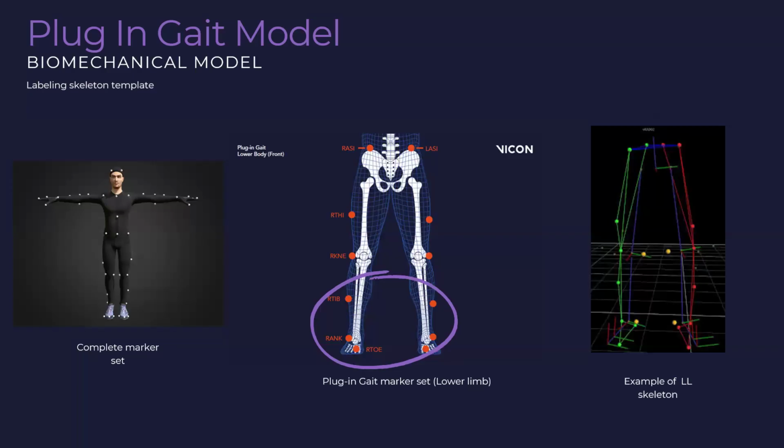And Vicon does it. Vicon includes a data acquisition system that you can input even the EMGs to, right? When you collect data, we have an EMG system, let's say the wireless EMG system that we use, which has its own data collection. You can just plug it in and start, or maybe synchronize these. But the inherent delay in the system, you cannot account for that. I understand that you're trying to synchronize in post-processing, and it will reduce that error, but at the same time, it's impossible to make sure that works perfectly.